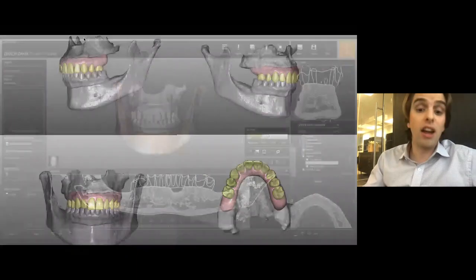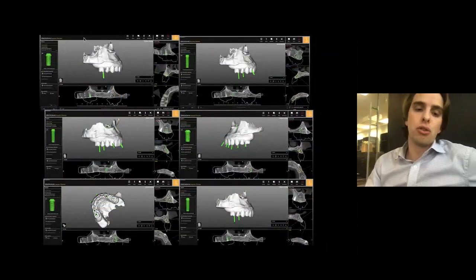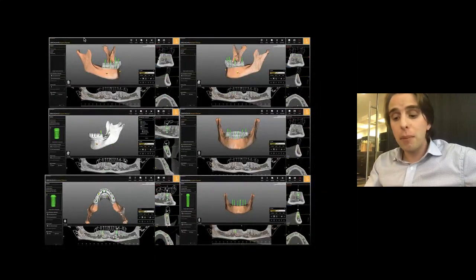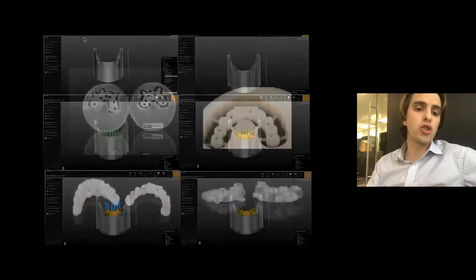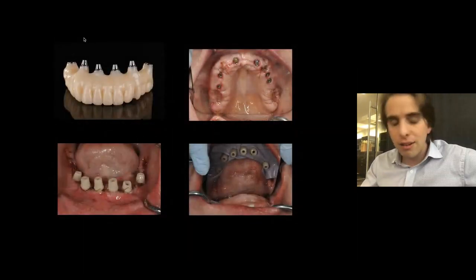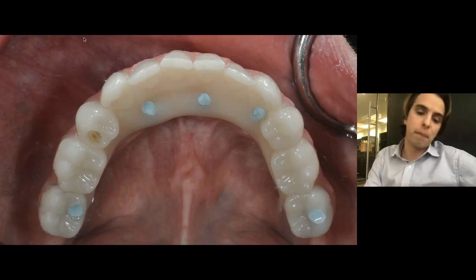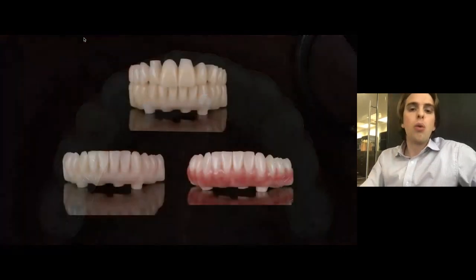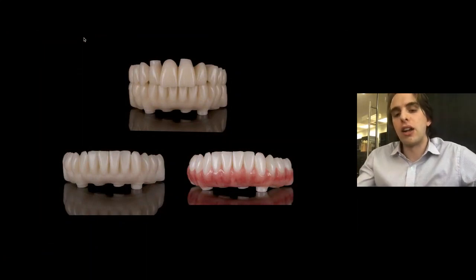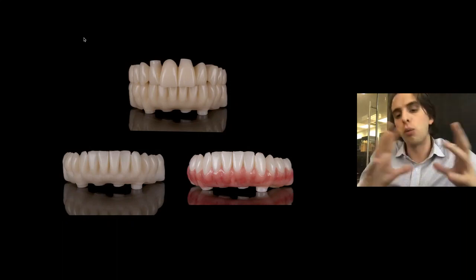But we can also take it another step further and go through actually an implant planning phase in the Zirkonzahn software suite where we can plan the surgery from a prosthetic point of view and generate a surgical guide which we can mill alongside our immediate provisional. And we bring this into the mouth, and we are much further along with our pickup. We might just have to widen one of the screw channels so that we can get the passive fit that we're looking for in a chairside conversion service that a laboratory should be offering their clinicians when we're going after these cases.